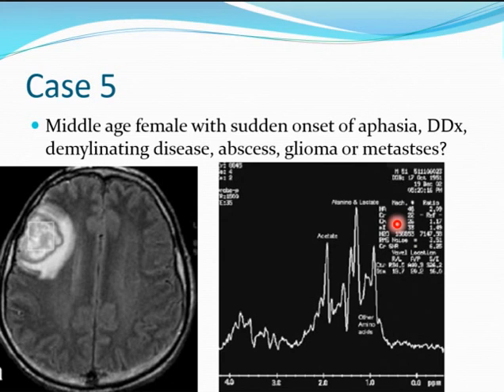Exactly, other metabolites should be seen. Yeah, different types of amino acids should also be seen with abscess than with metastasis. Metastasis is not from the brain. You should have a spectrum that no one can understand. It's different metabolites no one heard of. Okay, sorry. Choline in metastasis due to increased proliferation might be seen more even than abscess. I agree.